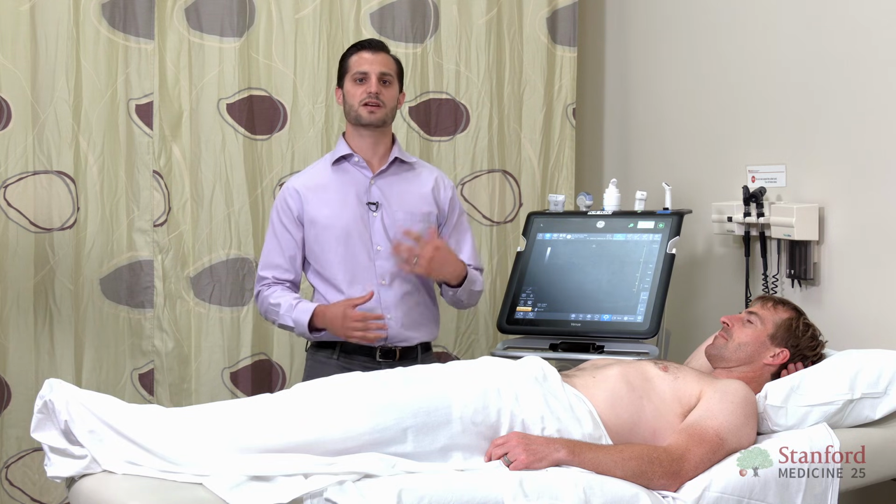Thinking about the indications and benefits of renal ultrasound, there are several things you can identify pretty readily at the bedside. These include hydronephrosis, nephrolithiasis, cysts, and the general size of the kidney. Things that are beyond the scope of point-of-care ultrasound include the evaluation of ureteral stones, vascular malformations, flow of the kidney, and determining if there are renal masses or malignant potential of cysts.